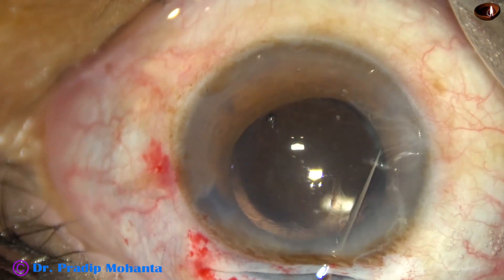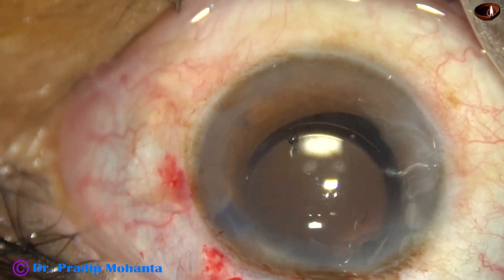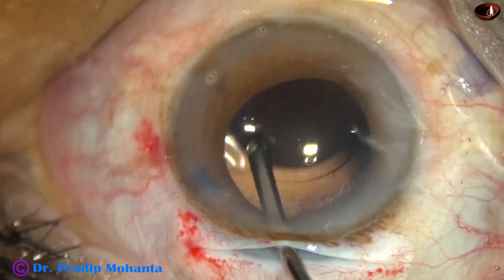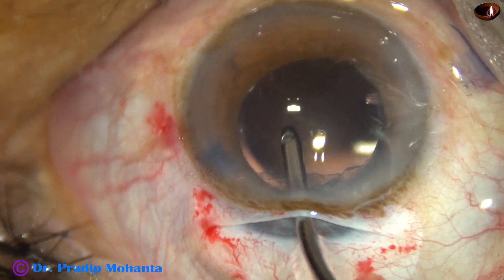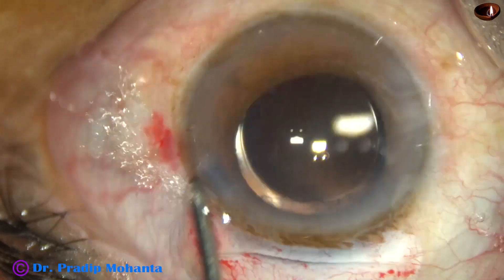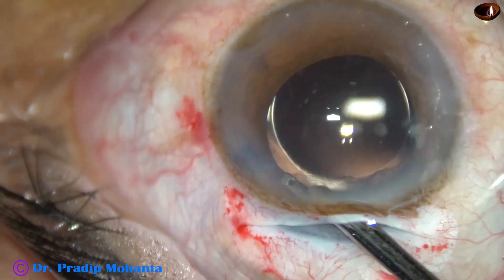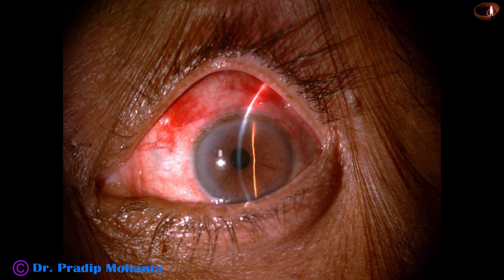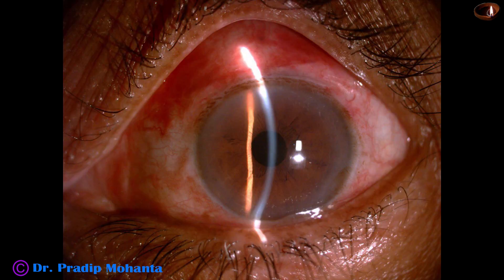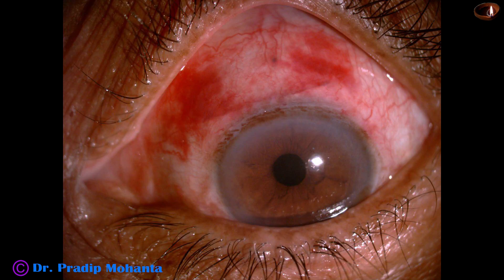The bag is good. There is a good amount of anterior capsular rim, so the haptics are placed behind the anterior capsular rim. There is no posterior capsule rent, so the lens settles in the bag nicely. See the beautiful postoperative picture after 24 hours — no corneal edema, anterior chamber quiet. There is very nice apposition of the conjunctiva to the limbus, and the patient gets 6/12 vision unaided.